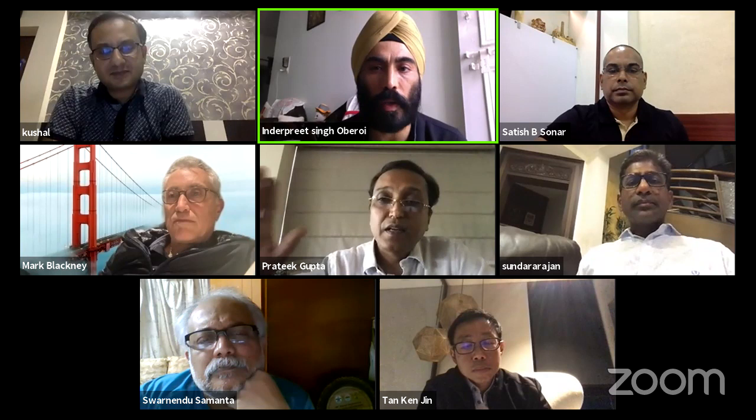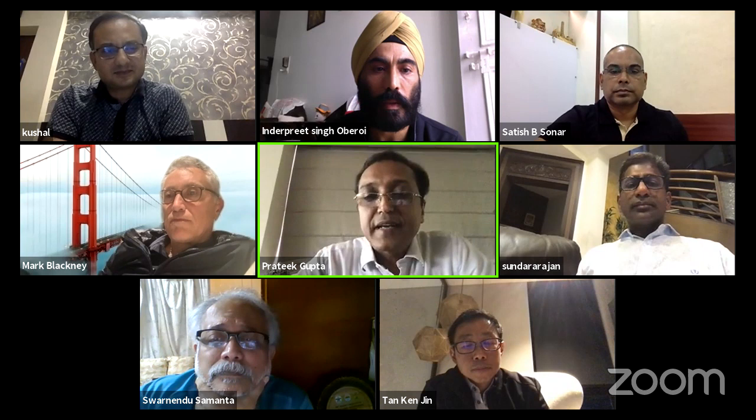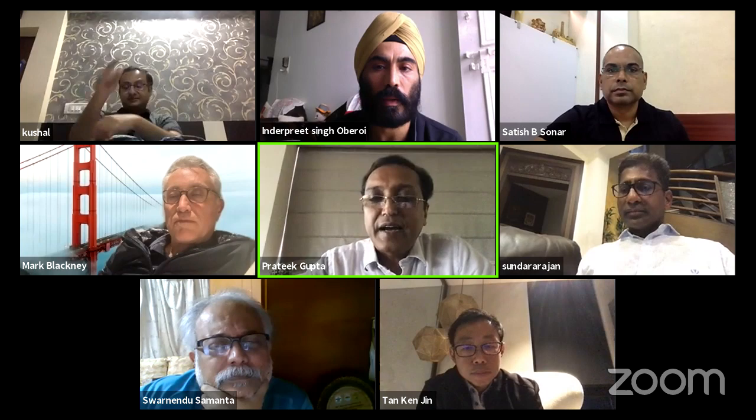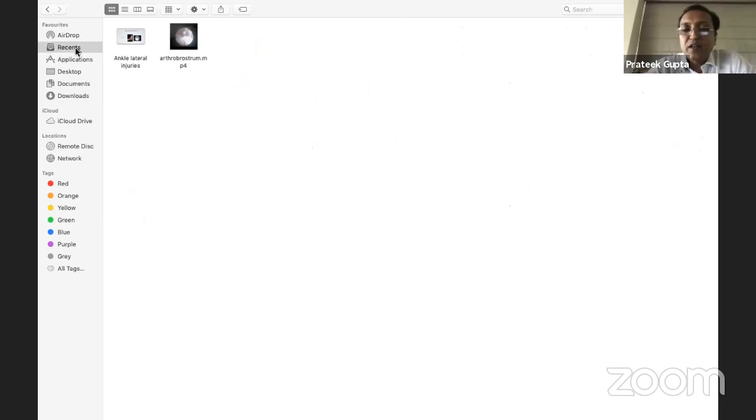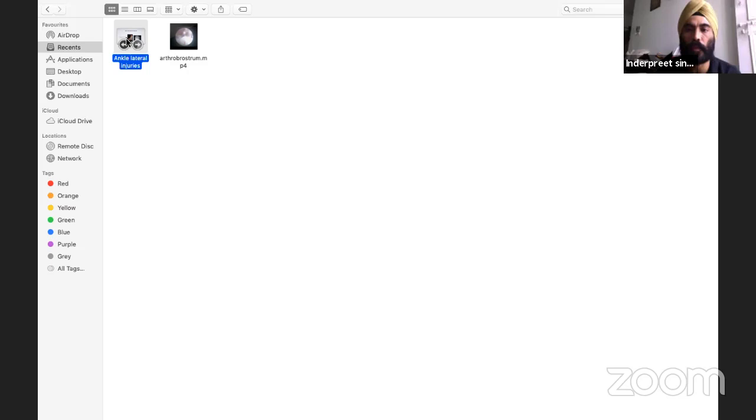I think yes. Pratik wants to speak something. Yeah, I just wanted to comment on that. You said there was a question about distractors, the different kinds of distractors. I don't know, Sundar will also be able to comment. There is a help which is available: there are two positions, one supine, and one hanging the foot at the end of the table, 90 degrees from the knee, in which case gravity also helps you, and just a gentle pull on the calcaneum can give you a view. Any of the faculty here would do a hanging ankle arthroscopy, something which Kushal, if I can.